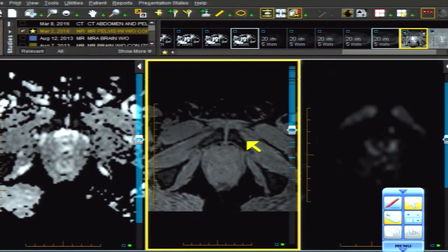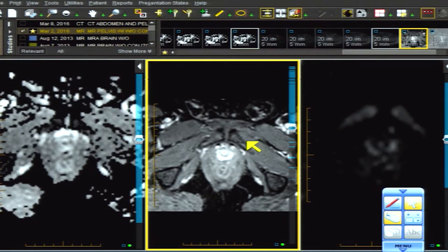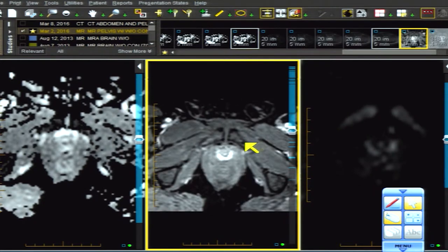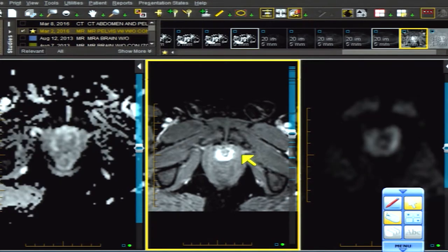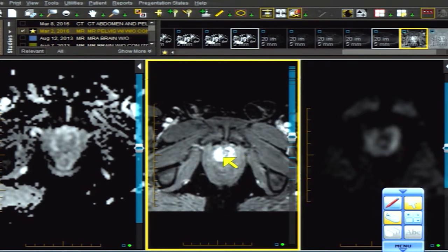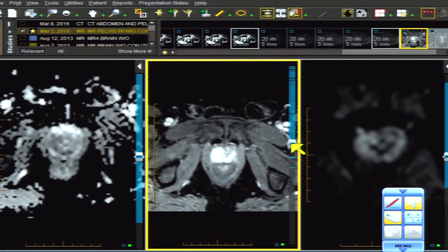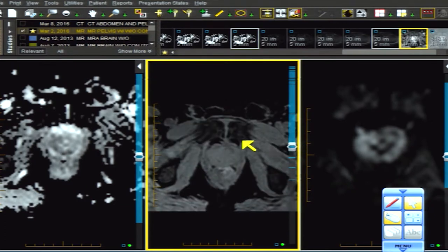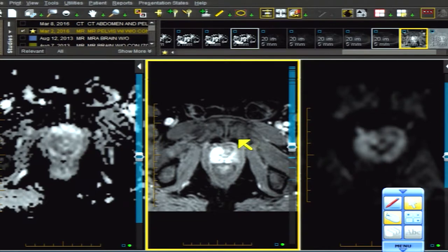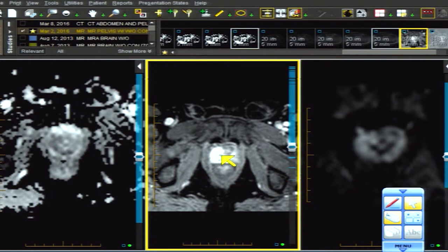Now we watch it get a little more fuzzy and a little thicker. Moving to the next slice — a little thicker on the right than left. Let's skip to the mid portion of the gland. Our ADC map is positive now because we have the volume to see it, and our diffusion weighted image is positive. The lentiform lesion goes all the way from the anterior gland to the posterior gland.